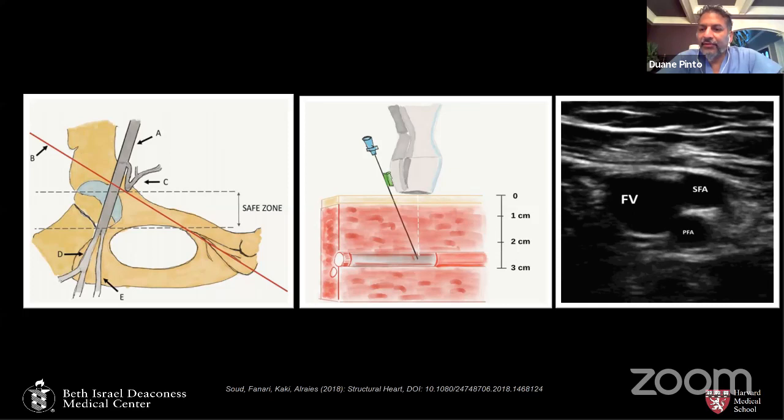As I point out, we very frequently use ultrasound looking for 2 arteries and then 1, and then we stick there. There are 2 modifications that I'd like you to add to your repertoire, and that is to scan over, in this case in the left femoral, laterally, and see the femoral head. In most patients, the femoral head is visible, and once again, as your second check, you know that you're at the level of the femoral head in a compressible area.